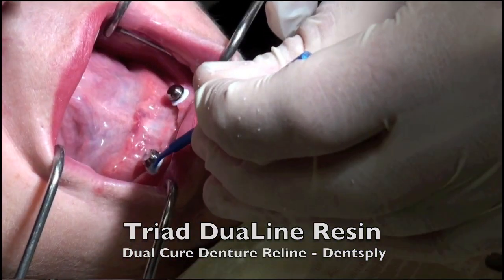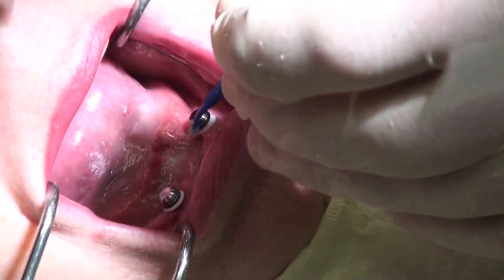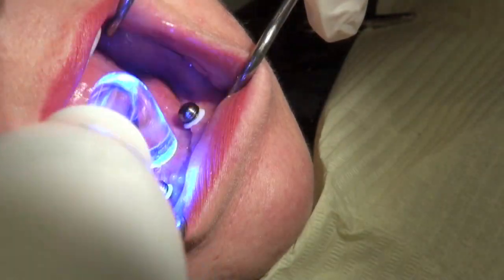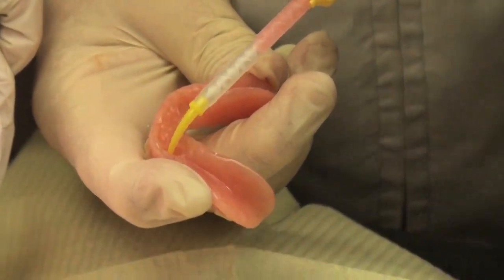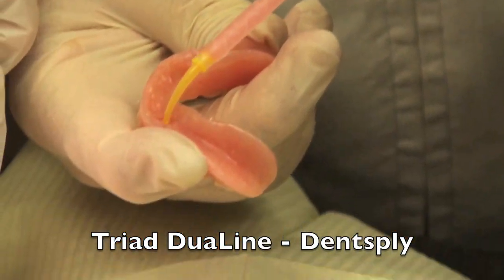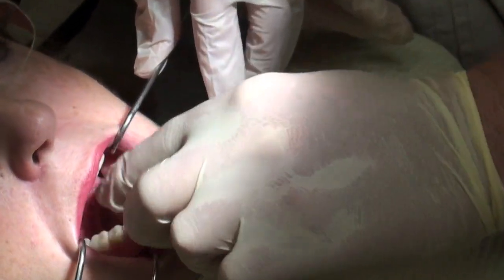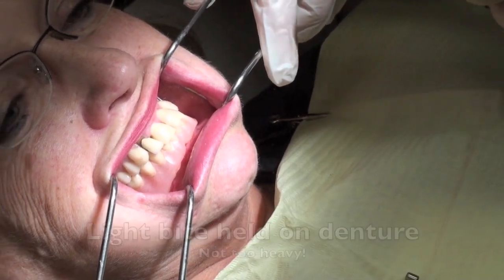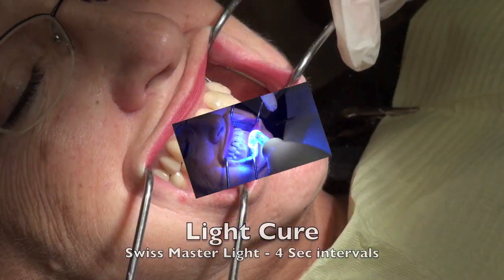We're going to take some Dual Line resin from Dent Supply, which is a dual-cure resin, and take that to the mouth. We'll apply a little bit of bonding agent right on the capsules themselves to make them slightly wet, then light-cure this to make sure the material is going to stay on those caps. We then bring the denture to the mouth, filling the Triad Dual Line resin into the little housing pits we've created. We inject this in — it will self-cure, but we also cure it with light. Any excess flows through the little holes created at the start. It's important not to bite too heavy, as this would push the denture down too far, so we want just a light bite.